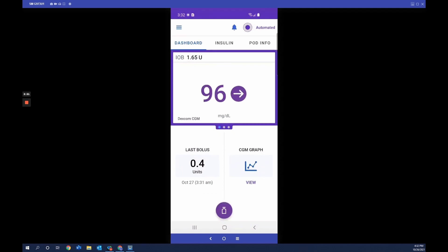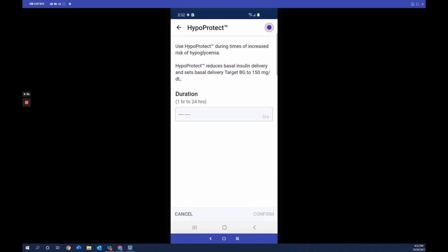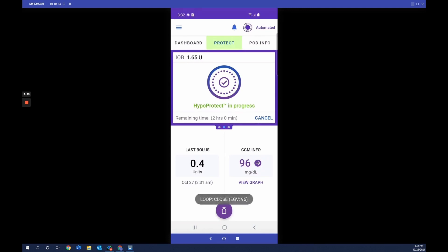While in automated mode, there may be activities like exercise or a sleepover when you want less insulin. To help with this, you turn on the activity feature — currently labeled HypoProtect in this software build. Tap the menu, then tap HypoProtect. When started, Smart Adjust technology reduces insulin delivery and sets the target glucose to 150 mg/dL for a duration you choose between 1 and 24 hours. After setting it for 2 hours and tapping Confirm and Activate, the insulin tab shows 'Protect.' After the 2 hours, the pod automatically resumes automated mode.